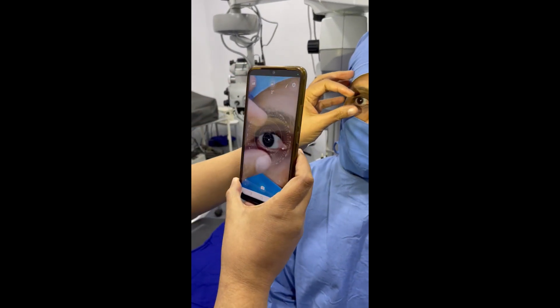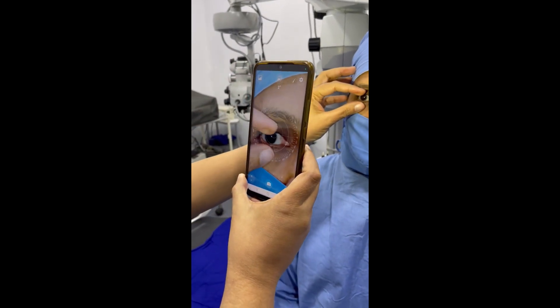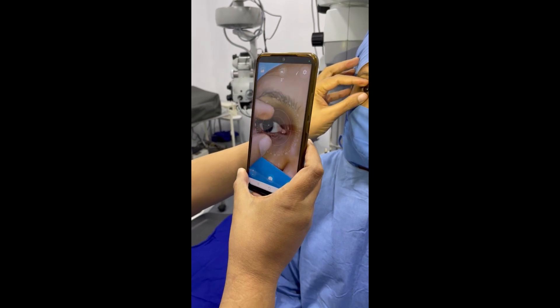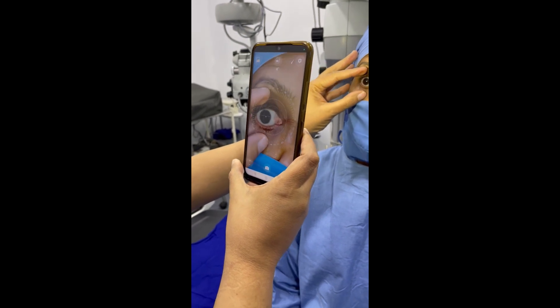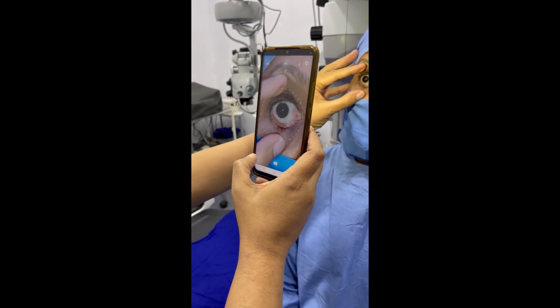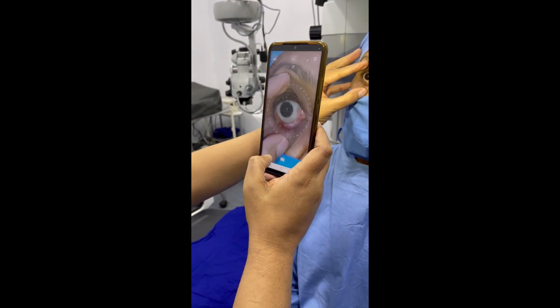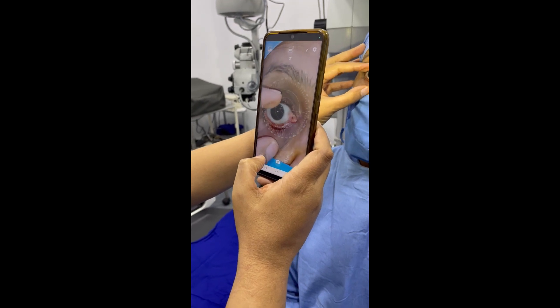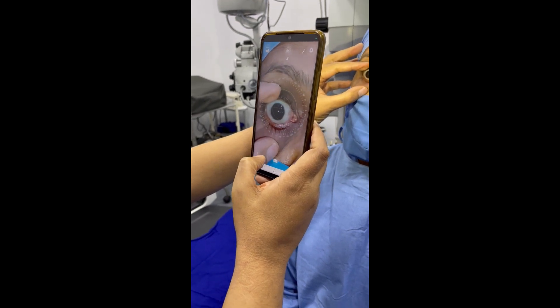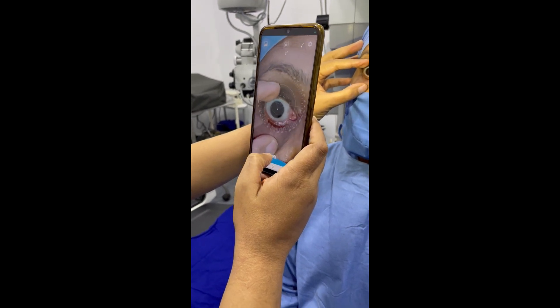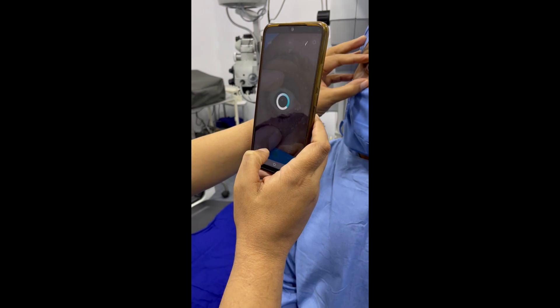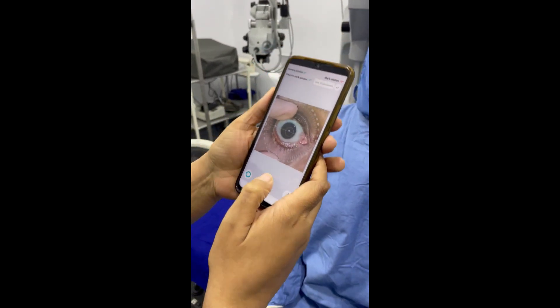There is no paracaine instilled, there is no speculum — this is not going to make the patient afraid. You just tell them we're taking a photograph of the eye, and make sure that the limbus is seen all 360 degrees.